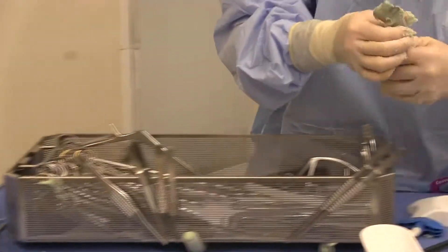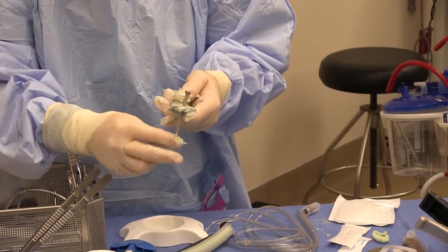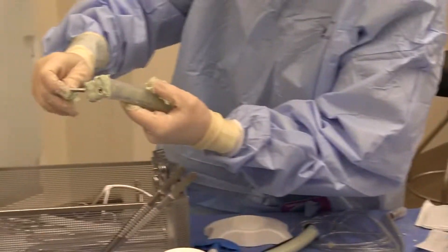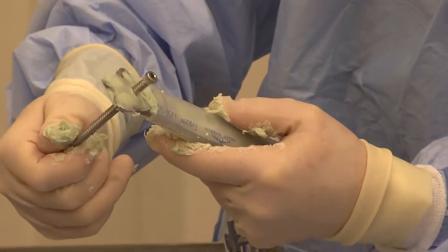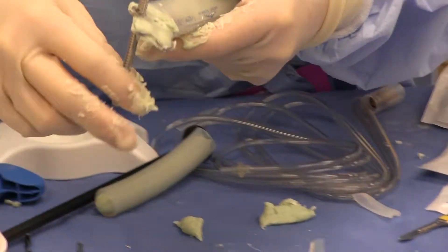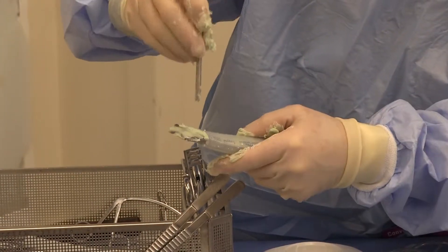Everyone's going to wonder what you want to do with these screw holes. There are two ways to do it: one, you could drill them out, or two, you could do this with your screw so that the screw threads are clear. When it's doughy like this, it's easy to work with. So I have a nice hole there, and then I have a nice hole there.